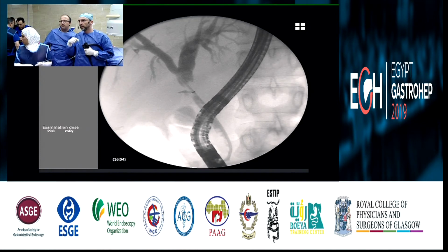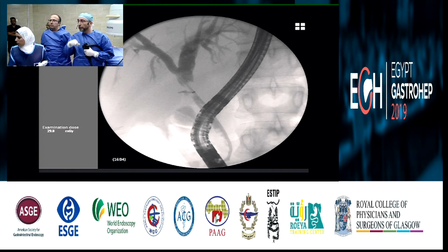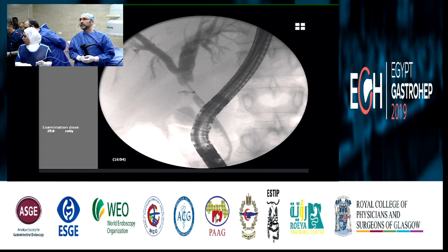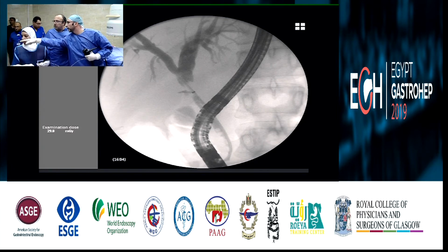So your plan now is to insert a plastic stent in one direction and a metal in the other direction. We will protect the right duct with a plastic stent, 8.5, 12, and then we will place a metal 8.5 across. And you will do a balloon dilatation first, or will you do the plastic first? Do you have the other wire?